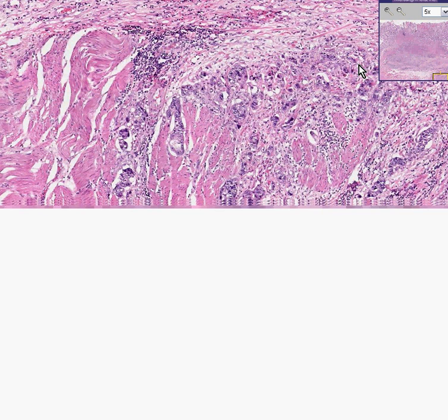However, I wouldn't be surprised if, in a case that looks as poorly differentiated as this, as large as this, and as widely invasive as this, it was already metastatic at the time of diagnosis. Thank you very much.